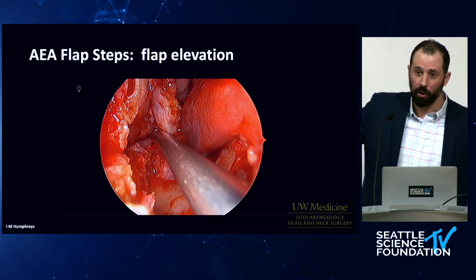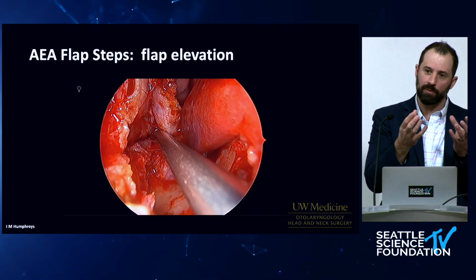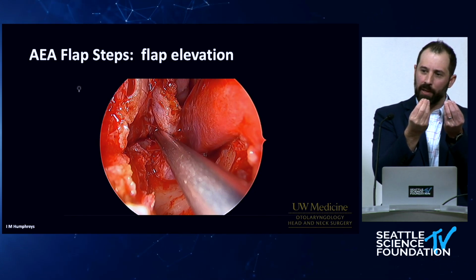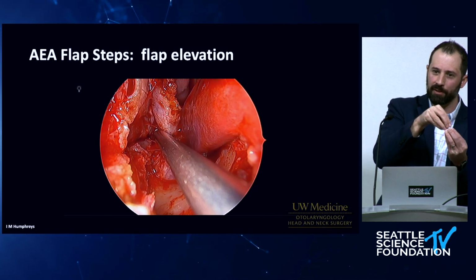Another area that has been a struggle for me is oftentimes patients can have a prominent incisive canal that comes up into the bottom floor of the nose, and you may see this when you're doing septoplasties, and it can have this little cone that comes down into the nasal floor.